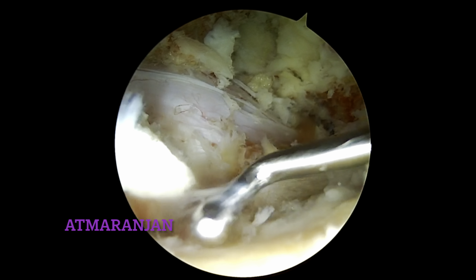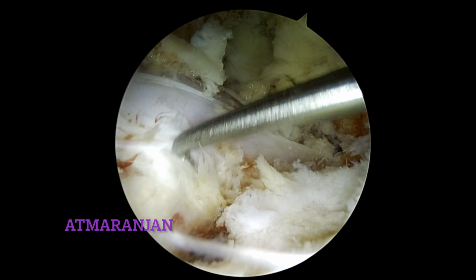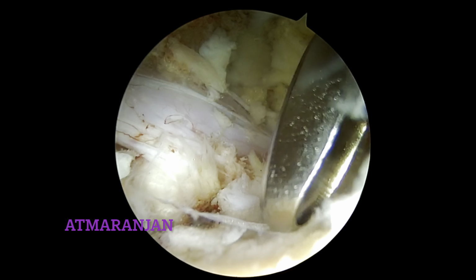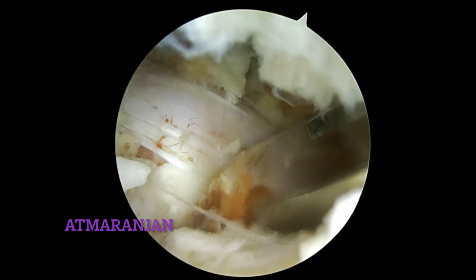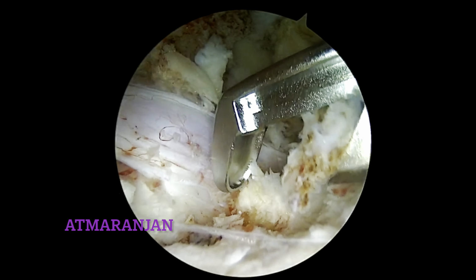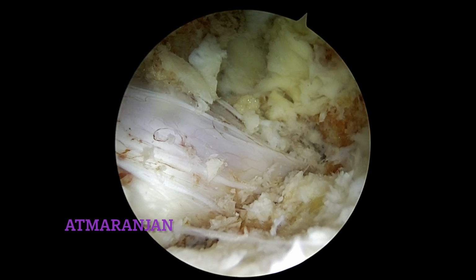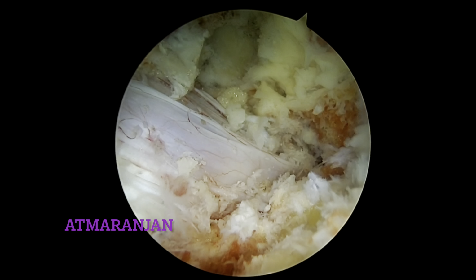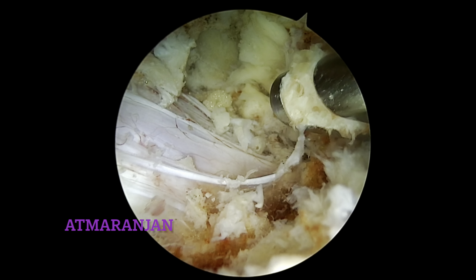This is the disc level. The fibers of the annulus are visible and the traversing root is also identified. Because the facets are hypertrophied, I am trying to remove the medial border of the SAP to make the traversing root more evident.